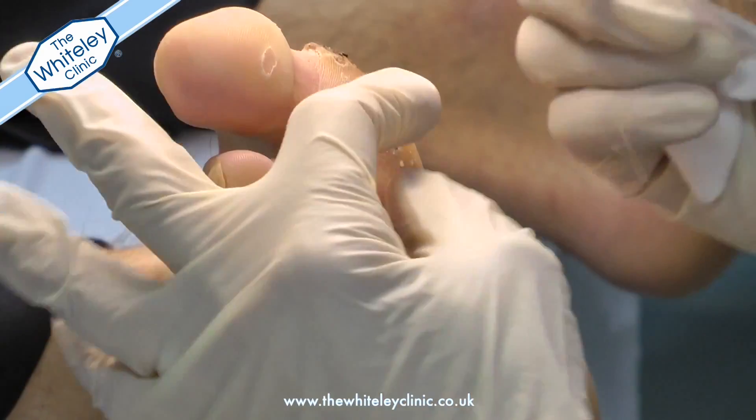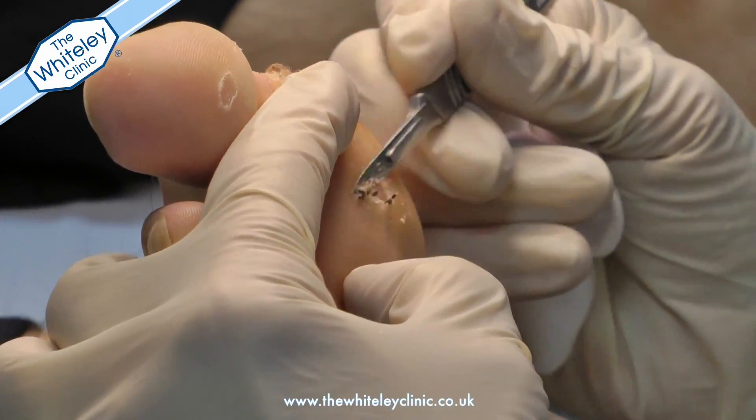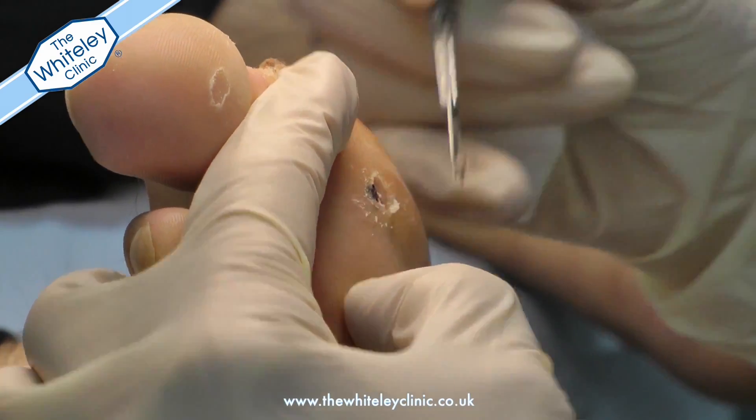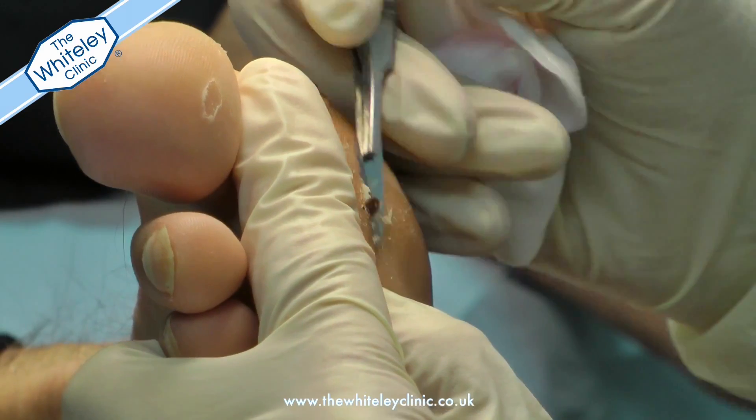After degreasing the area to be treated, the hard skin or callus is then removed from the verruca and the surrounding area. It is then cleaned or debrided before the laser is used.